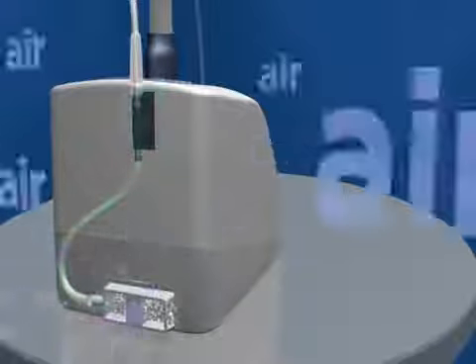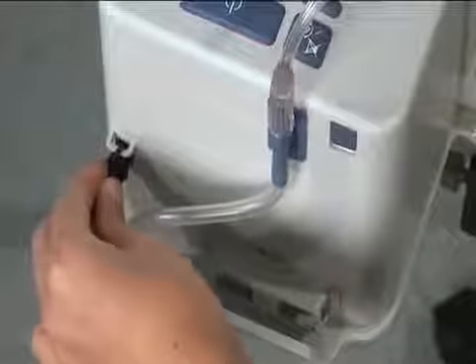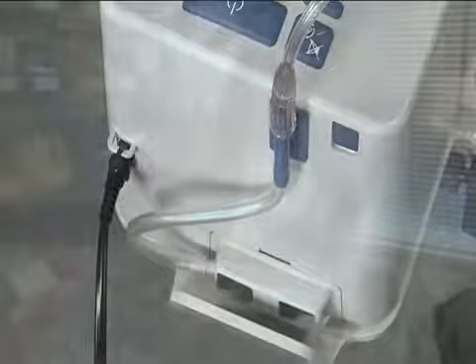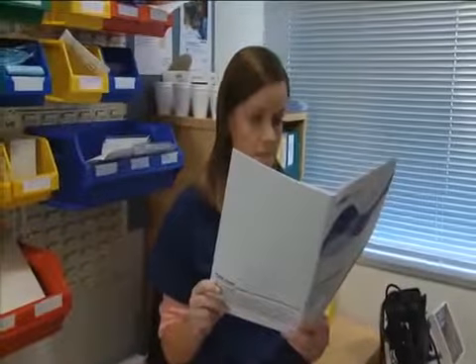The extension kit adds oxygen at the inlet port on the back of the Airvo. This supplementary oxygen mixes with room air before being filtered, warmed and humidified inside the Airvo. Before use, make sure the oxygen kit is securely attached to the filter holder, that the filter holder is not loose, and that the power cord is secure too. Be sure to read the warnings for oxygen use in the operating manual before using oxygen with the Airvo.